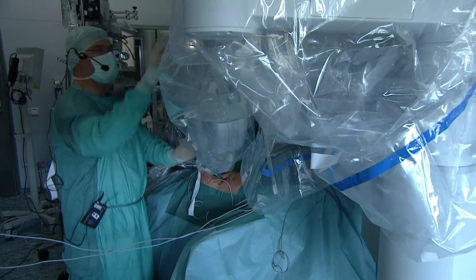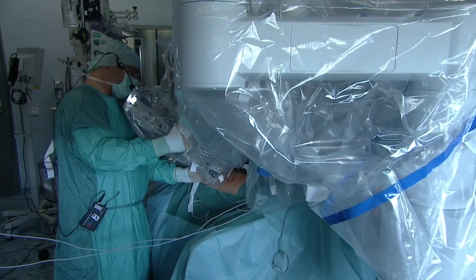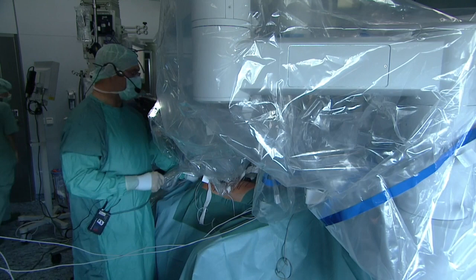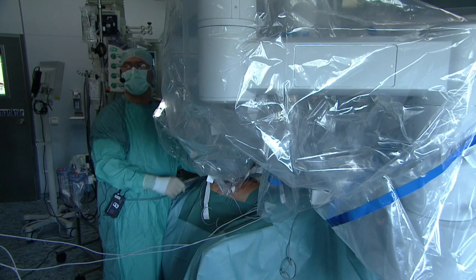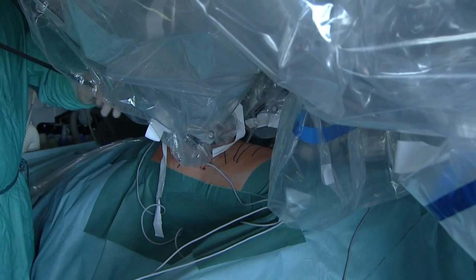Yes, I understand. And in your experience, how many percent do you do retroperitoneal and how many percent transperitoneal? It's about 60% retro, 40% trans. So obviously you have a slight preference for the retroperitoneal approach for this surgery, is that correct? Yes. I know some people that do all retro, but I think the anterior tumors are challenging to do retroperitoneally, because I like to see tumors face on. I like to be able to see them. Scissor, please. The same reason I would do a posterior tumor retroperitoneally, I think an anterior tumor is better done transperitoneally.